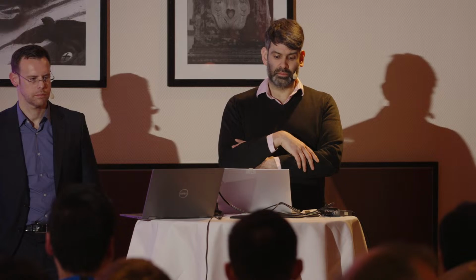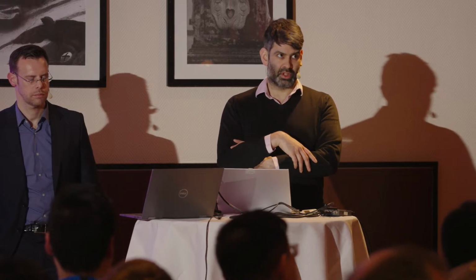I tend to stick with the 014, simply to make it easier for my stockroom guys to reorder, and also because a lot of the other devices that we use will go over an 014 wire. So just to minimize wire exchanges during the case, I tend to stick with 014. Some people find the 018 useful, me less so. Definitely for aortic, the 035 is much more helpful to get the field of view.